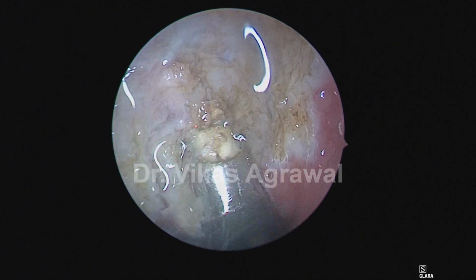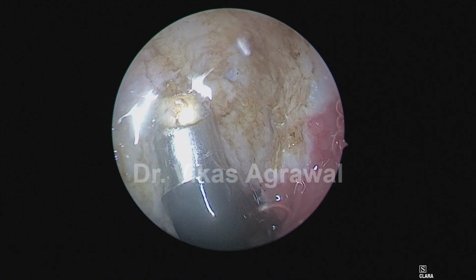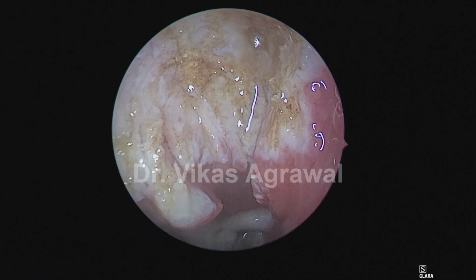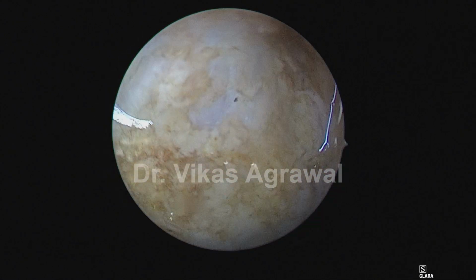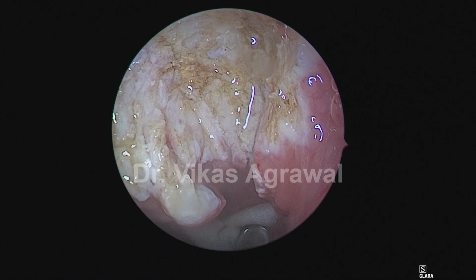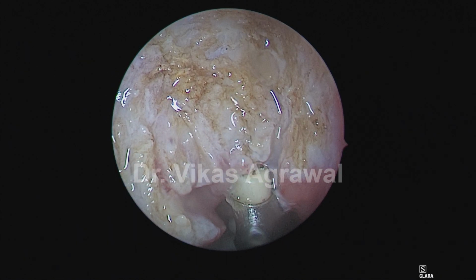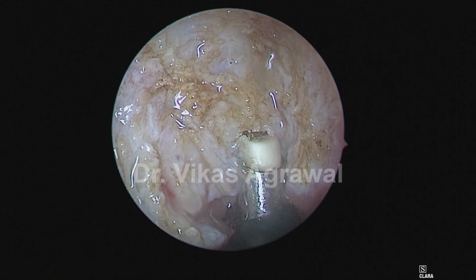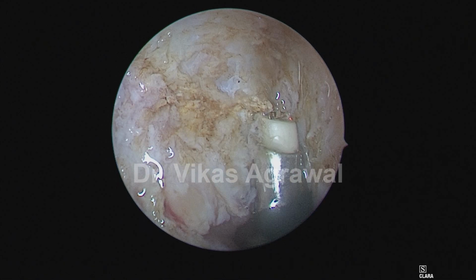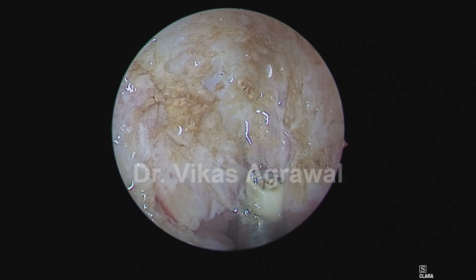Now we'll go for the posterior boundary, which is buccopharyngeal fascia and the entire extent. Can you just clean it? So you can see the buccopharyngeal fascia very clearly. Now I need to define that buccopharyngeal fascia in the entire extent. So we will go layer by layer, remove all the lymphoid tissues, as you can see here.